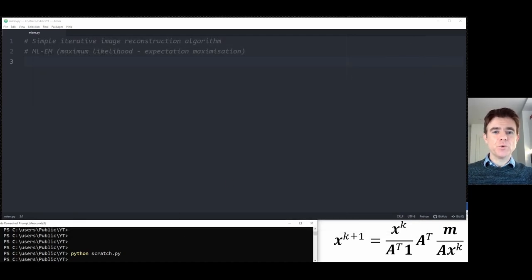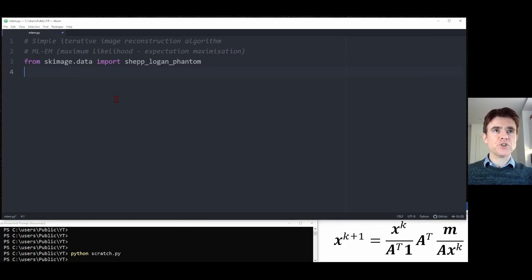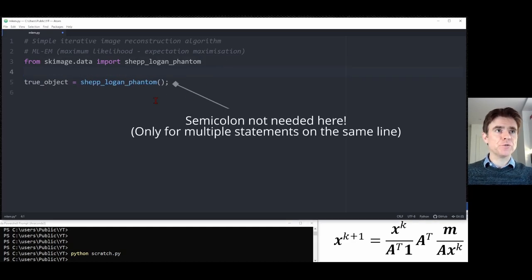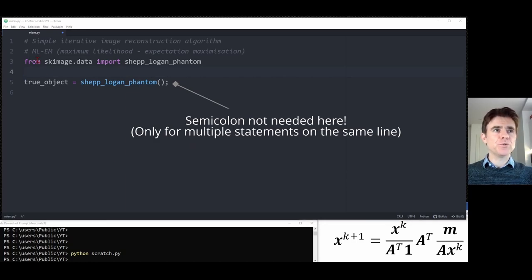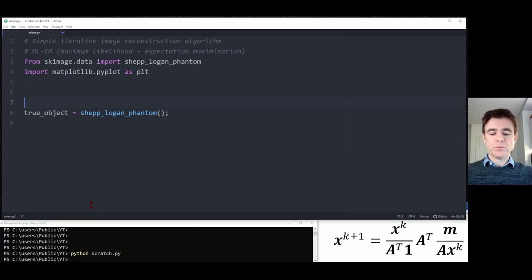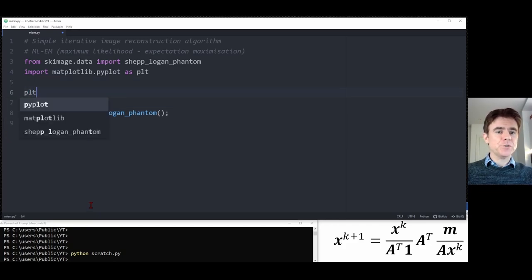Let's get underway in Python. First of all, we're going to need to access that true object, the Shepp-Logan phantom. For that, we'll be using the scikit image processing library. We want one truth object — the Shepp-Logan phantom — and we'll want to take a look at that, so we'll use the matplotlib library, and we'll want to be able to have updating figures.